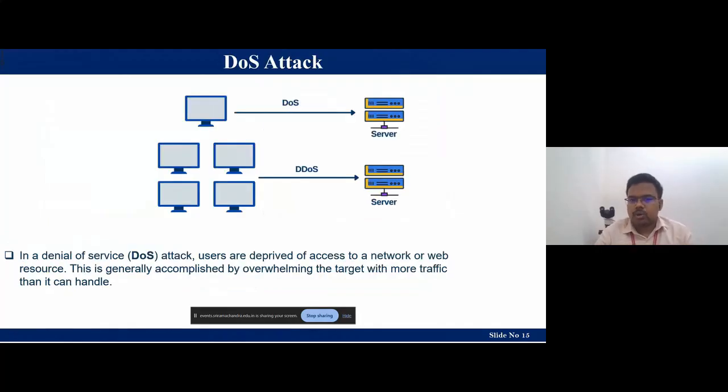Then another important attack in the medical area is called DoS and DDoS. Here, for your understanding, I am using a client server model. In the normal case, we use different types of medical devices at the left side, and the server is nothing but the cloud area where the data are stored, and from the cloud all this data will be fetched into the client side application.